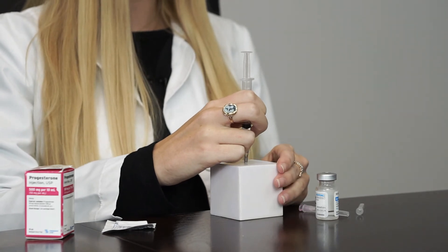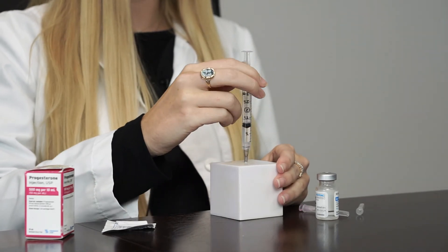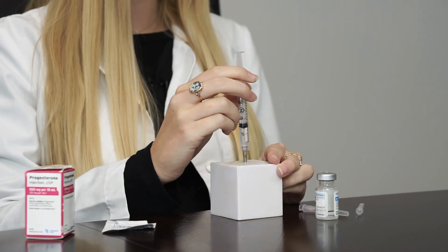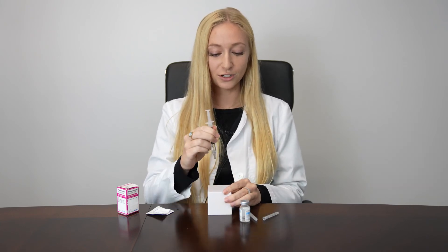The first step is to aspirate, which means to gently pull back on the plunger. If you see a little bubble or nothing at all, you're okay to inject the 1 cc. If your syringe fills with blood, stop — it means you're in a blood vessel. Withdraw your needle, move a little bit to the right or left, and then try again.